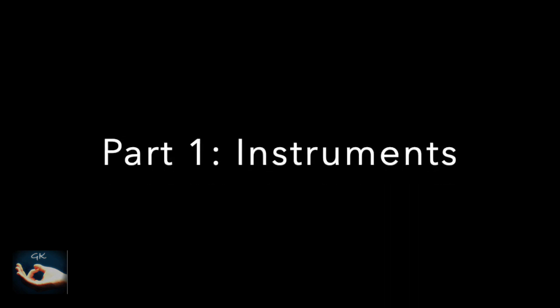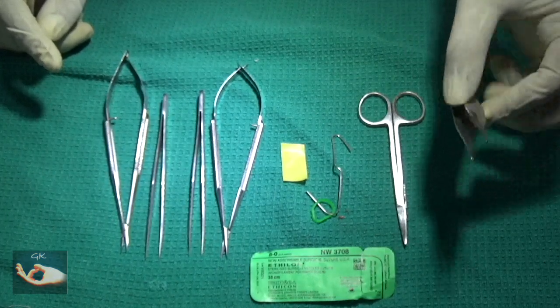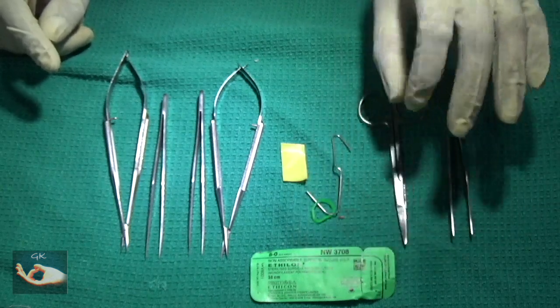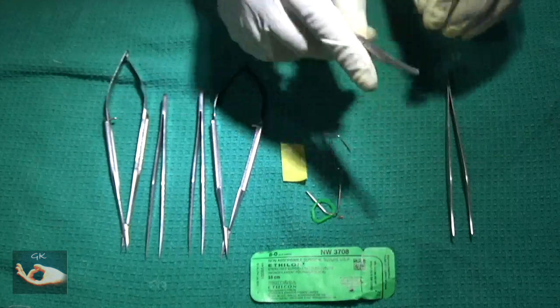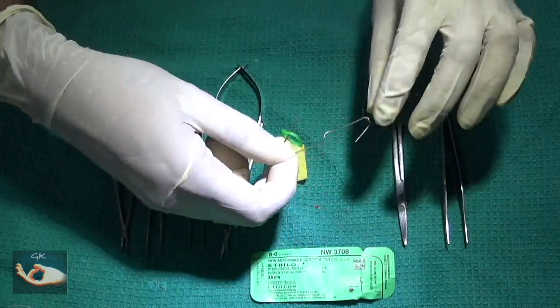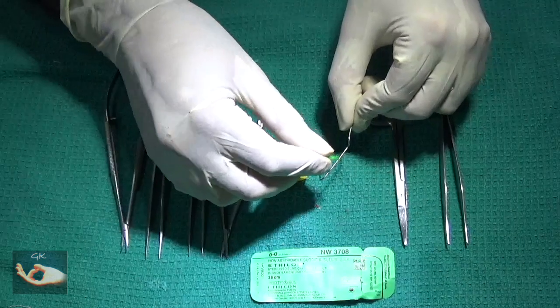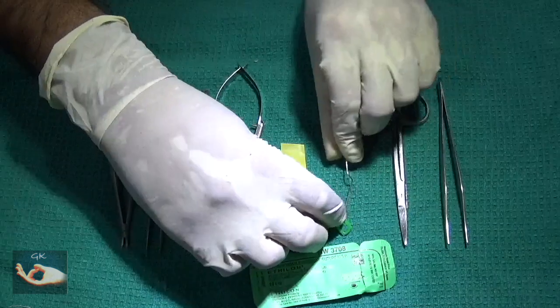We will be seeing the instruments we will be using for today's dissection. The first is the toothed thumb forceps. The second is the dissecting scissors, curved. The next will be a self-retaining retractor in the form of a bended clip, which can be retracted by using a rubber band and a pin that has been provided to you.